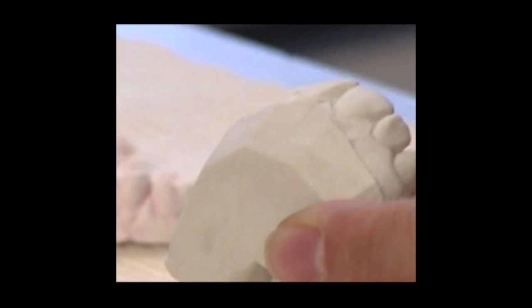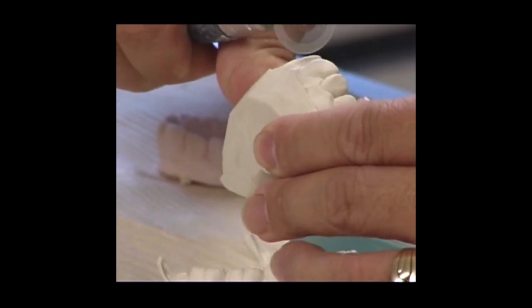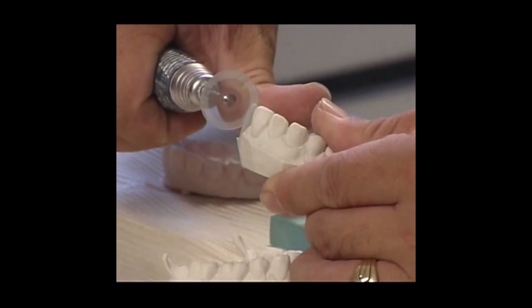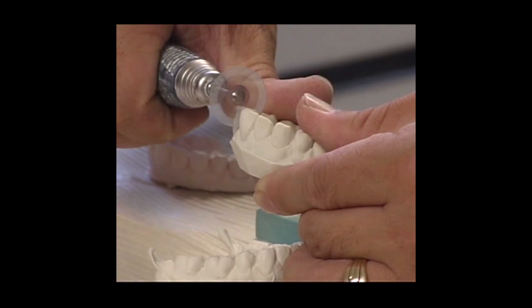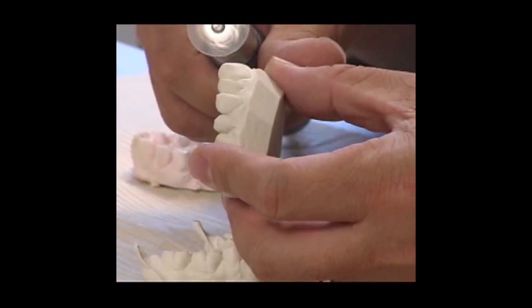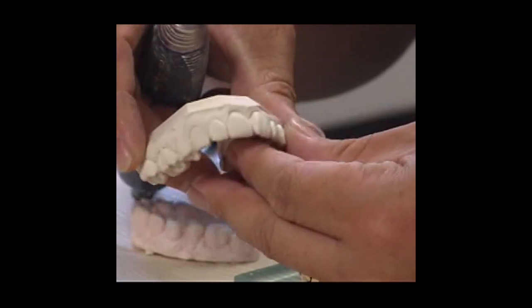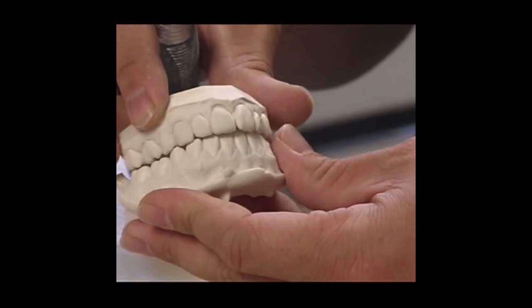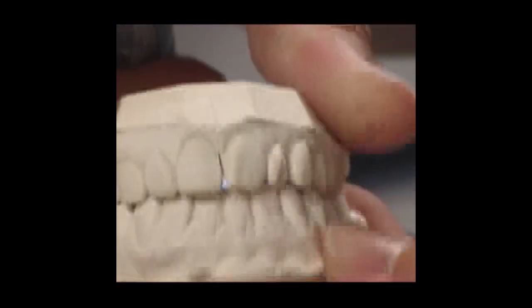Now, adjusting the model is easy with the disc. Just go right through between the two centrals. Again, this is just a mock-up and it's nothing to do with the clinical procedure. So we just separate nicely and evenly with the disc. So now we know where the midline is going to be with the lower counter model. It's pretty much lined up, and measure up number 8.